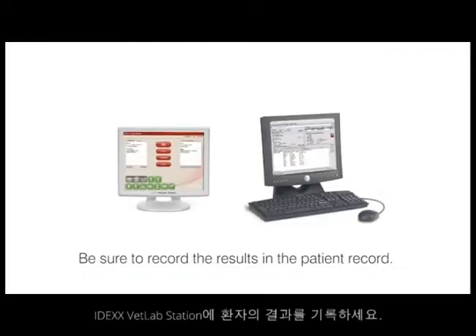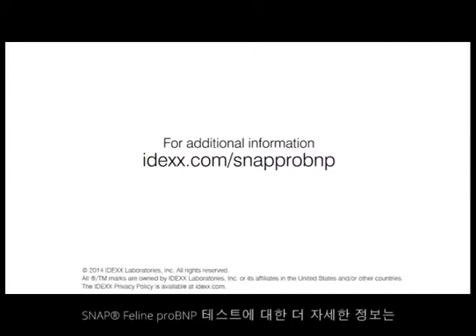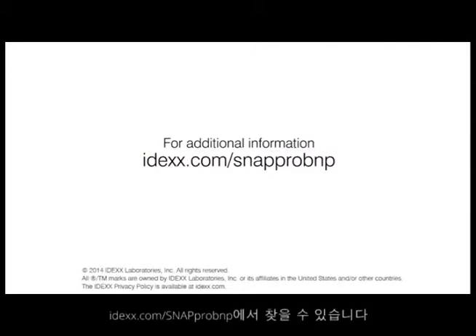Record the result in the patient record, such as the IDEXX VetLab Station or other practice management information systems. For additional information on the SNAP-Feline ProBMP test, please visit IDEXX.com/SNAP-ProBNP.